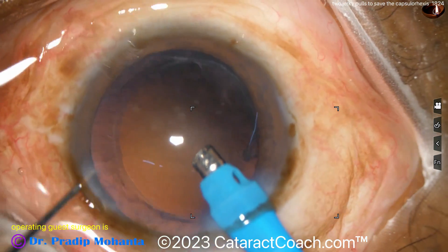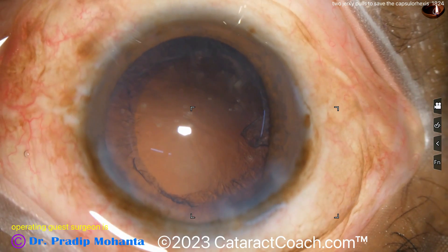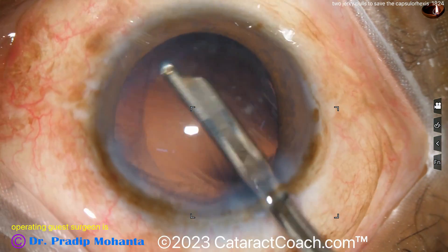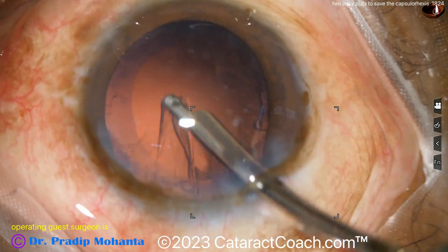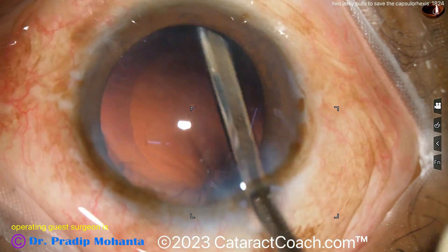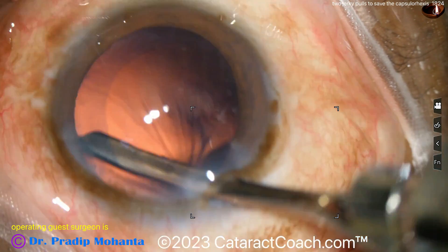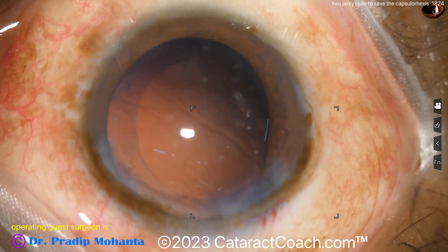Now it's cleaned up quite nicely. I want to see at the end here where the lens is in the bag and see what kind of overlap we got. A little viscoelastic and now a Simcoe cannula to clean up the cortex, get all that cleaned up nicely. The lens is going in and this patient is going to have an amazing recovery — from essentially no vision to great vision, overnight in a brief procedure.